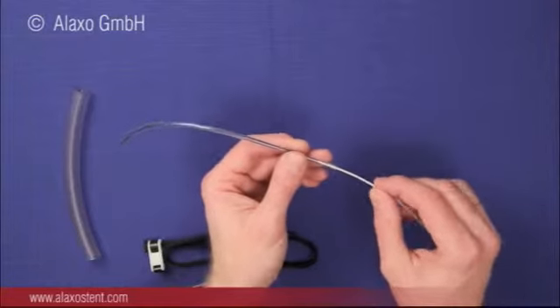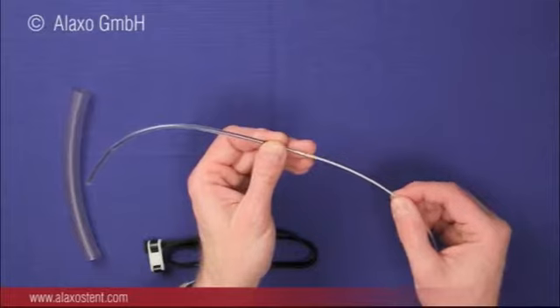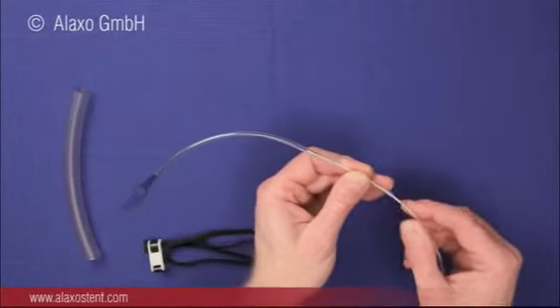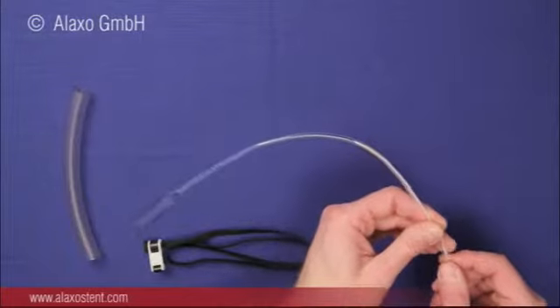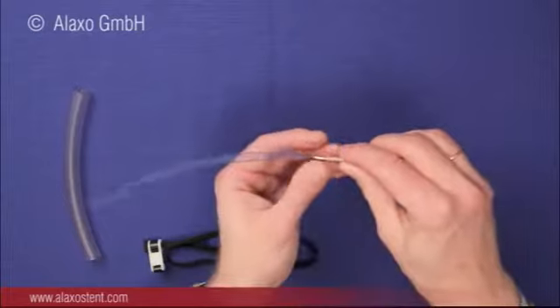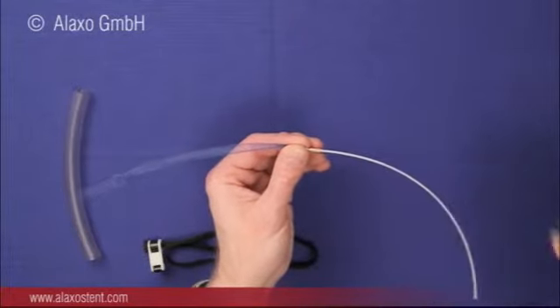When the target position has been reached, the pusher is fixed with one hand and the introduction tube is slowly pulled back with the other hand. Thereby the stent is released and self-expands in the throat. The introduction tube is fully retracted and then the pusher disconnected.